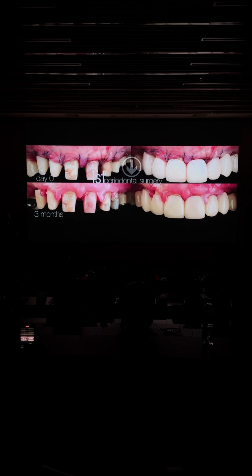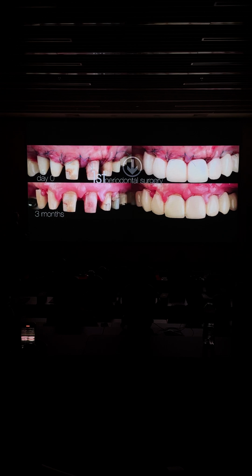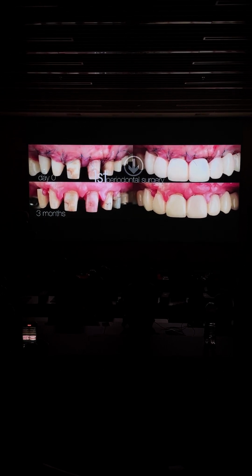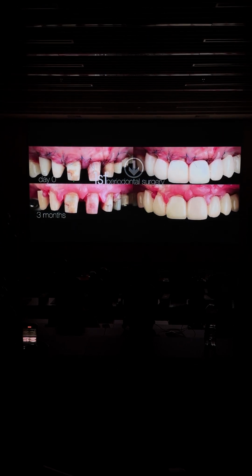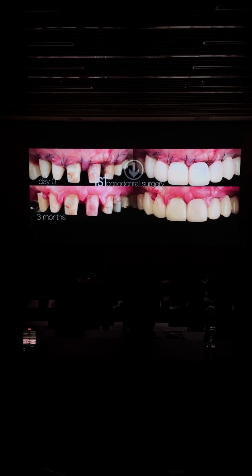I took advantage at that time and reduced cervically, with an open flap, the roots already in the first surgery, trying to have the same root diameter, especially on the line angles between the different teeth from a canine to a first premolar, to come up with teeth that look the same. So I do a lot of root plasty. Thank God those teeth already had root canals, so it was not such a big problem.